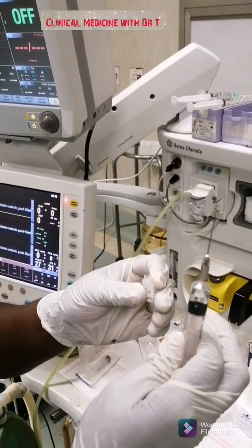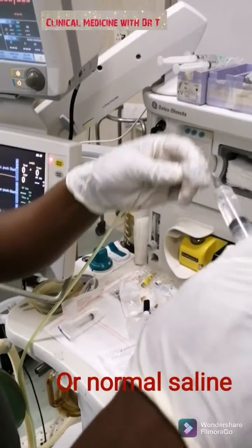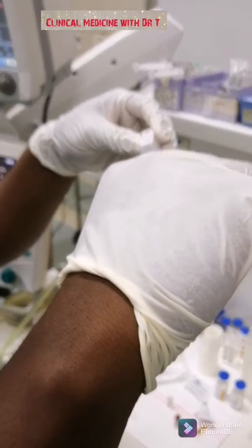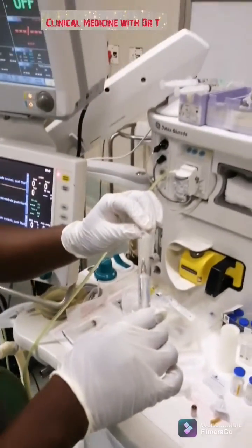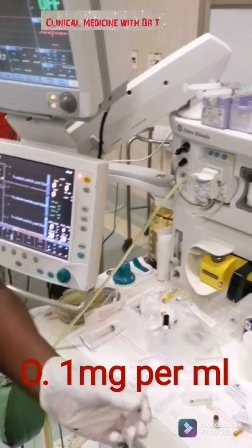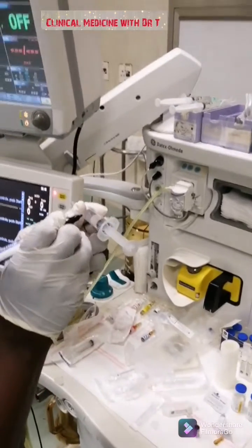Add 4 mLs of sterile water. By adding the sterile water, we have created a concentration of 0.1 mg/mL — remember it was 0.5, so now it's 0.1.